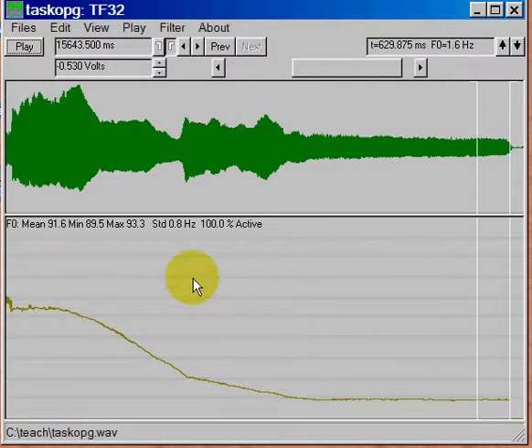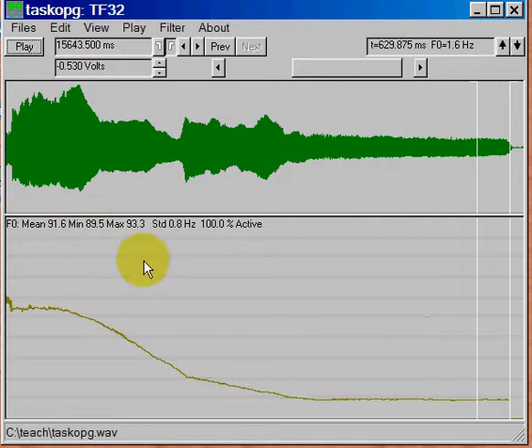And then we go over here to where my fundamental frequency is at its lowest. And this time we look for the min number. And the min number here is the minimum value between the cursors is 89.5. We'll round that to 90 hertz. So now we have the minimum value.